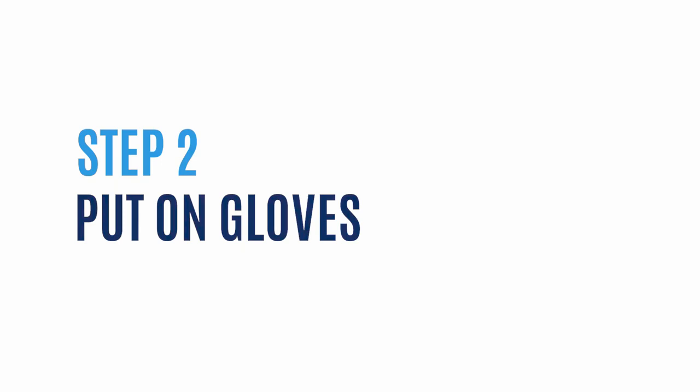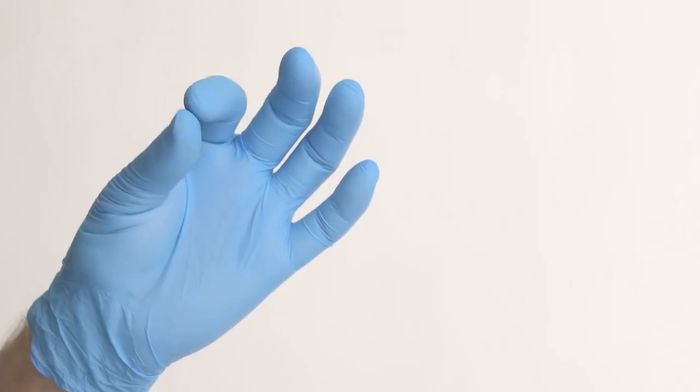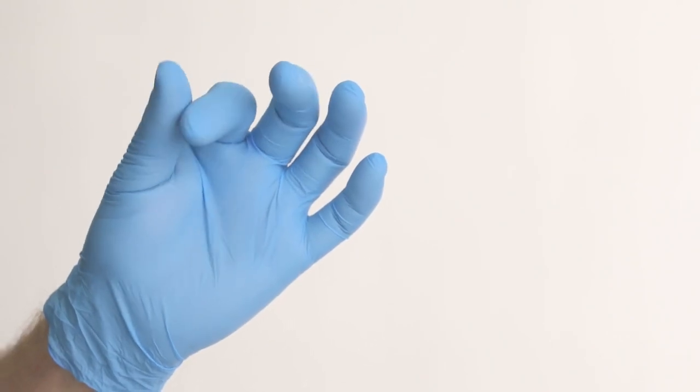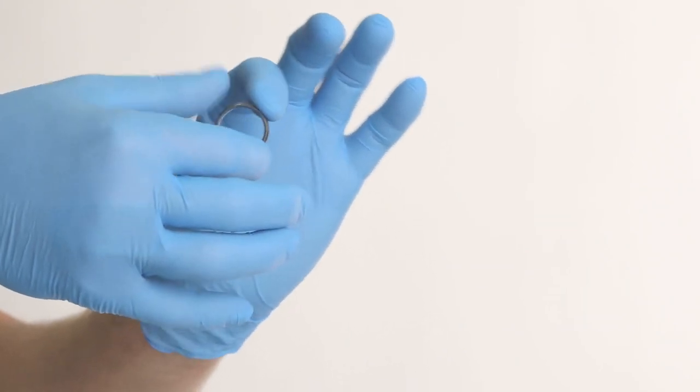Step 2: Time to put on your gloves. Place the gloves on your hands for proper ring removal. The purpose of the gloves is to provide traction with the ring when the lubricant is applied. This is especially important when you're trying to remove a smooth wedding band.